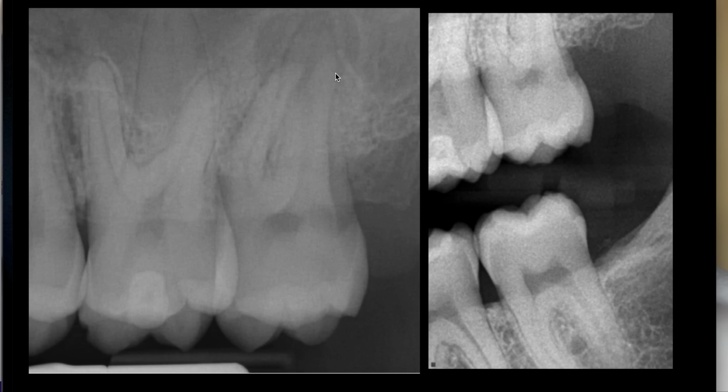I wanted to go over a really quick video. This is a calcium hydroxide refreshment, and I'll do it here and there. Sometimes we'll place really long-term calcium hydroxide, and sometimes, like in this case, I'll show you the reason why we elected to. Actually, I was looking at my dental assistant like, what do you think we should do? And she was like, if this was me or my mom or my dad, I'd probably refresh the calcium hydroxide.